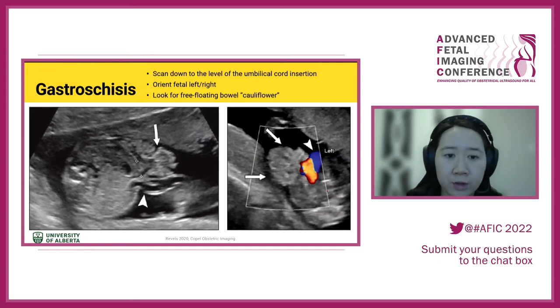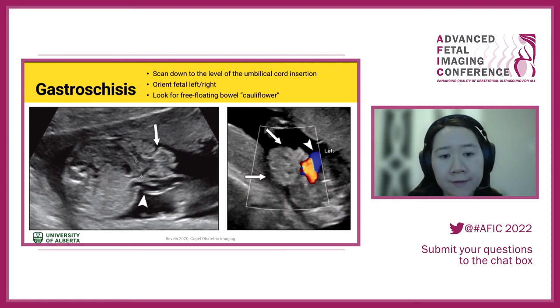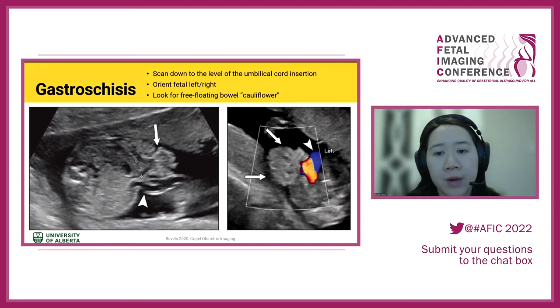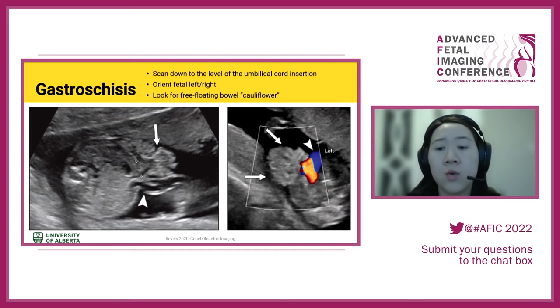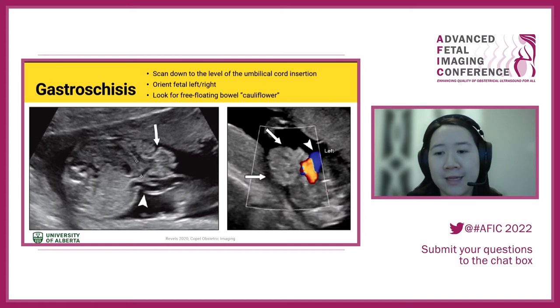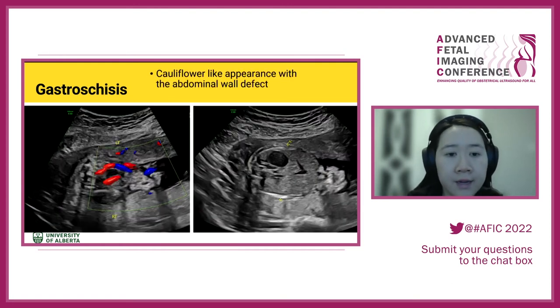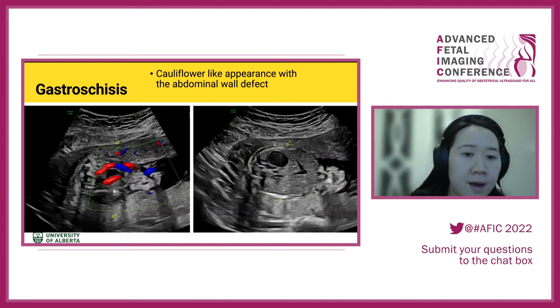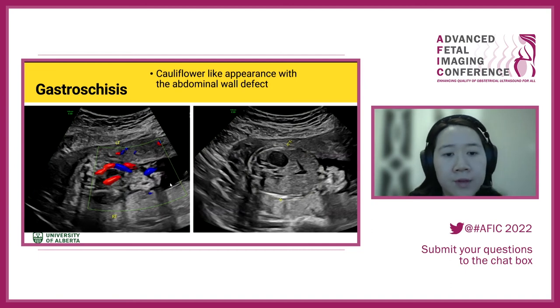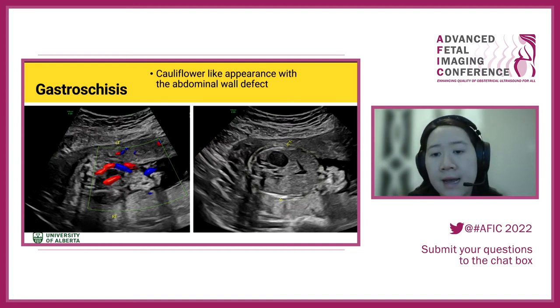When looking at fetal gastroschisis, scan down to the level of the umbilical cord insertion. On the left image, you can see the cord insertion and the abdominal wall defect just above it with a cauliflower-like free-floating bowel. On the right image, the cord insertion is to one side with a hyperechogenic lesion adjacent to it attached to the abdominal wall — that's your extruded bowel. In another case from our clinic, you can see the umbilical cord vessels along the left side and the defect on the right.